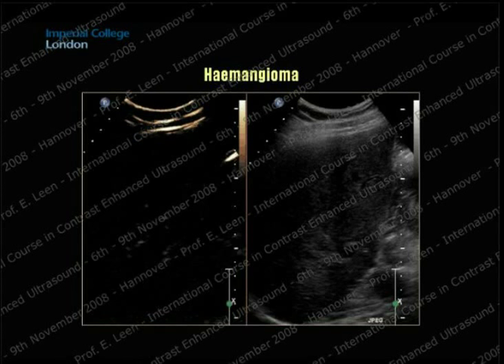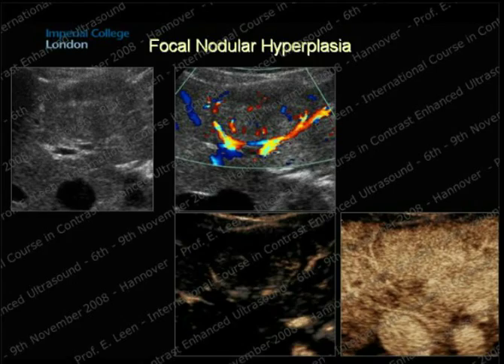Hemangioma, we've already been told before, we're looking for the centrifugal or centripetal filling in of the tumor as time goes on. You can see the lesion, as you keep on looking in time, gets smaller and smaller, and eventually you may have complete filling of the lesion. And the last of the group of lesions which we commonly see, baseline FNH, isoechoic to the adjacent liver.